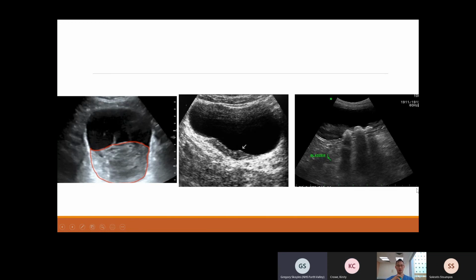So at the top of the image is the bladder. There are multiple irregular shaped hyperechoic foci with acoustic shadowing behind them. Yeah, so they are dense structures, maybe bladder stones. You are absolutely spot on.